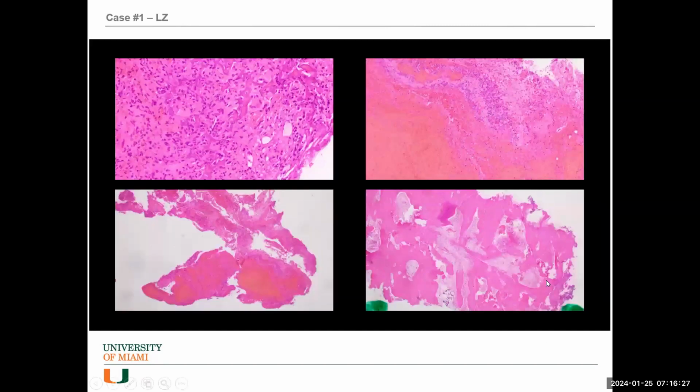Yeah, so here on the left upper picture, you can see this lace-like new bone formation. Now, when pathologists see this, they say, oh, maybe there is an osteosarcoma, but the differential includes a healing fracture, a fracture callus. In this case, we didn't see any atypical mitoses, infiltration of atypical cells. Most certainly no carcinoma in this specimen. I looked at it twice. Elizabeth looked at it. She signed it out. It would be difficult to miss a carcinoma if it was here, like a metastasis.